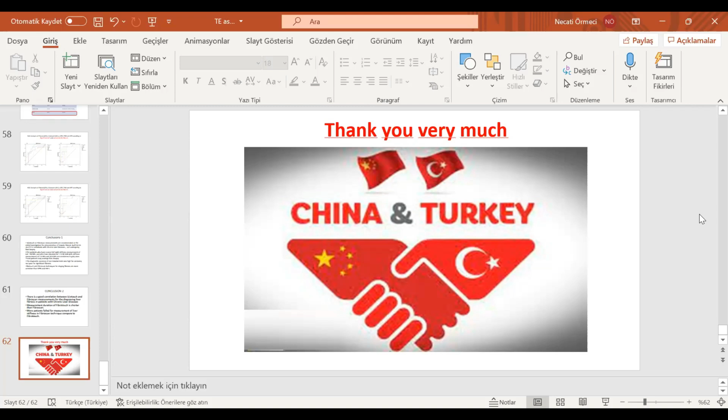I think there is no role of liver biopsy just for showing this, because it is an invasive procedure. In cases of advanced cirrhosis, 40 or 45 or 50 kilopascal means these patients have clinically advanced liver disease, and most of the time you already have the diagnosis. There is no need for liver biopsy in most cases just to document that this patient has a very high level of fibrosis.